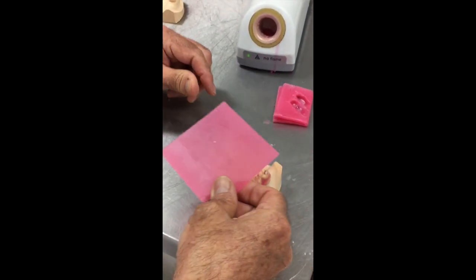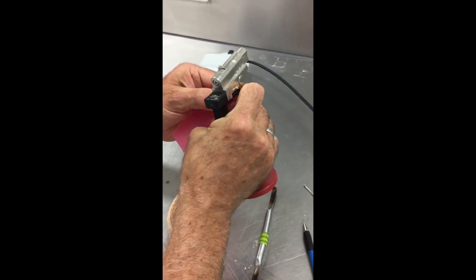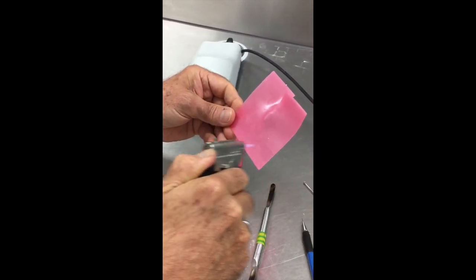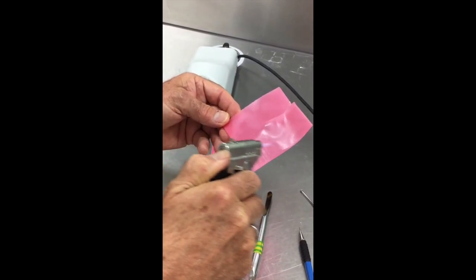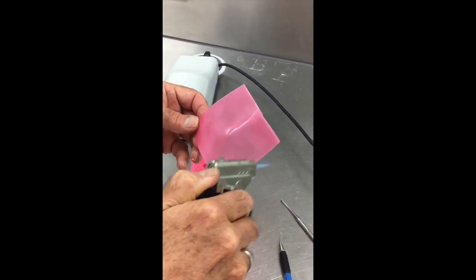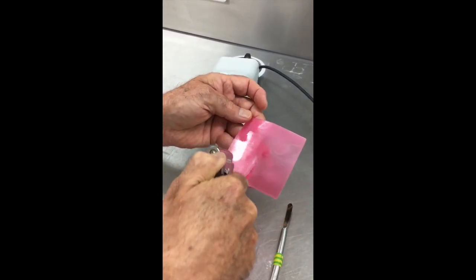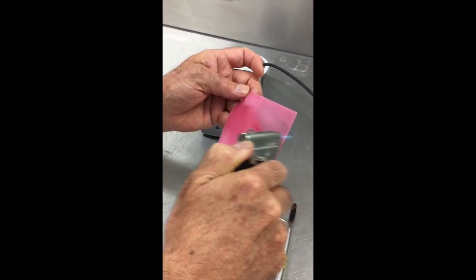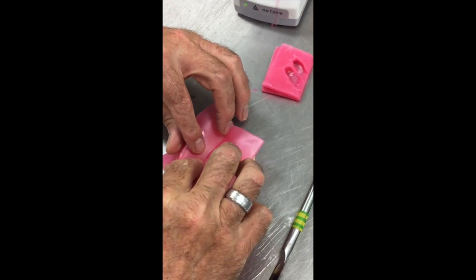Now I'm going to take my sheet of wax and adapt one sheet of wax to this model. This is just standard modelling wax. You could use boxing wax, which is slightly softer. In the end, my decision on using modelling wax is that it is a little bit more resistant to pushing thin, because the idea of this layer is to provide a consistent thickness of the spacer so that we have a consistent thickness of the impression material.